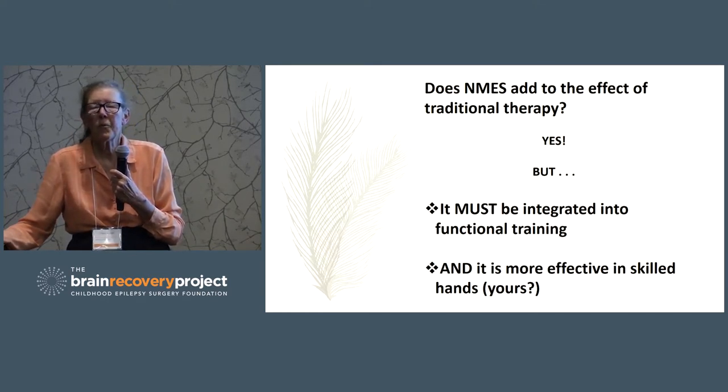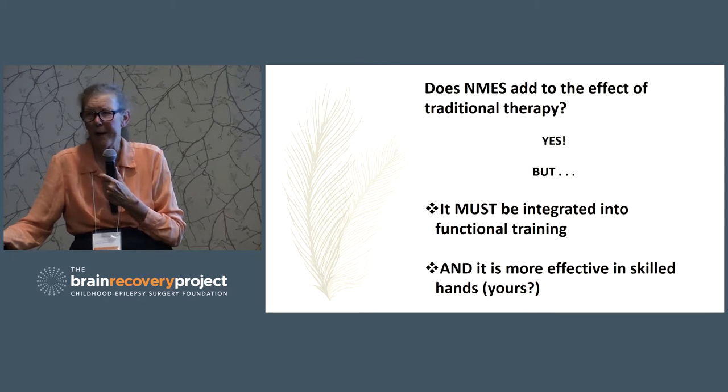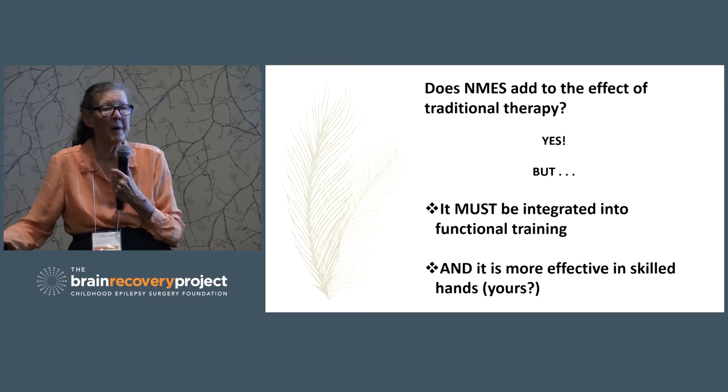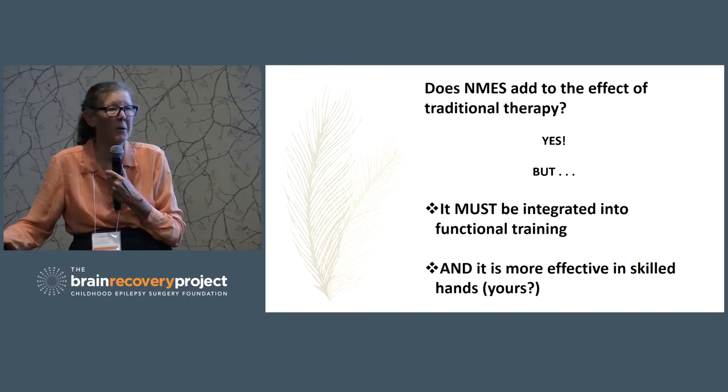So therapists are in a position to be knowledgeable about electrical stimulation if they do a little homework. However, you are the one that sees your kid every day. And it doesn't take a lot of finesse to figure out how to make some of these programs work. You need a good motor point chart or an upper extremity or lower extremity anatomy, and look to see where the muscle is. Try it on yourself. Figure out where you should be putting the stimulators and put them on and go with it. So you need to have probably some help from your therapist, whatever therapist it is, at the very beginning.